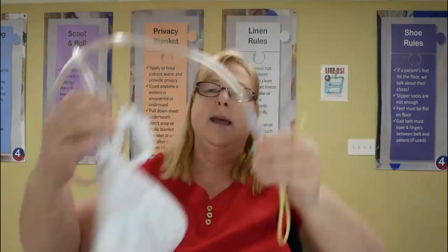Nothing can get in here. There's no way for anything because it's not open to the air. It's not open to anything. This end is in the patient, and this end is closed. So it is a closed system. As long as we don't let any bacteria into the system, it's fine.